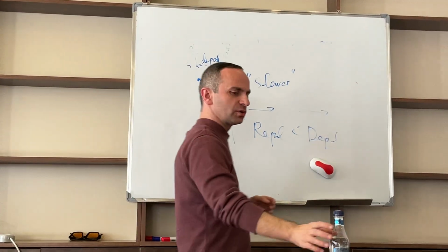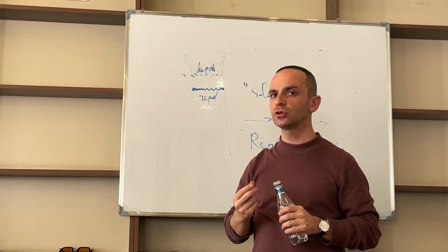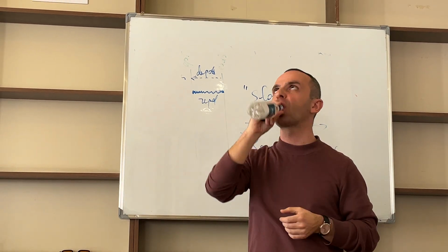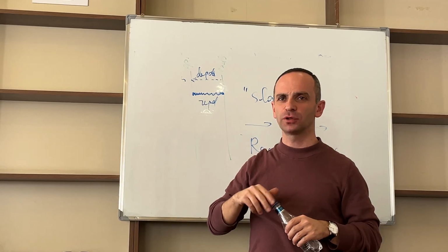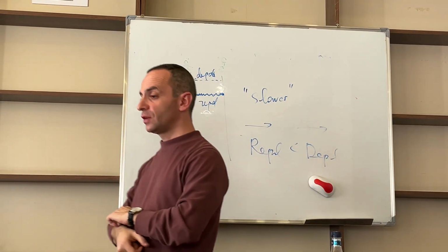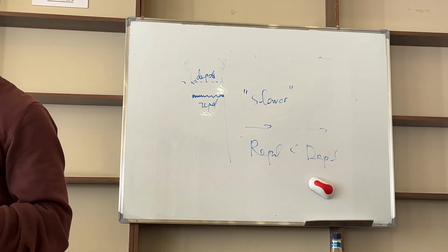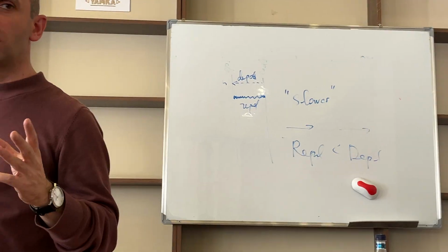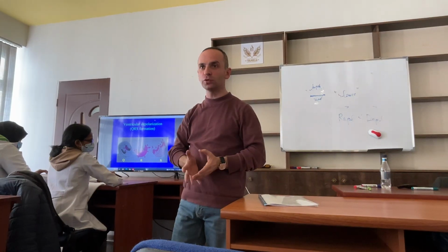For understanding how this QRS is formed, we are using one method which is called method of extrapolation. You know what does it mean? Extrapolation is if for judging about subjects which are more, we are taking less sample, and knowing what happens here, we can spread this information on the whole.